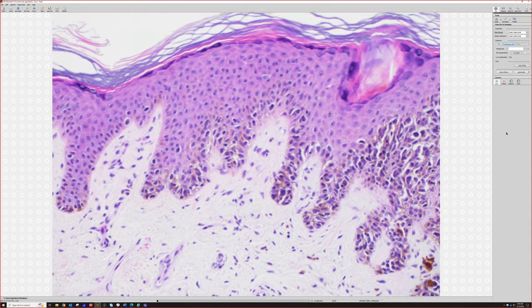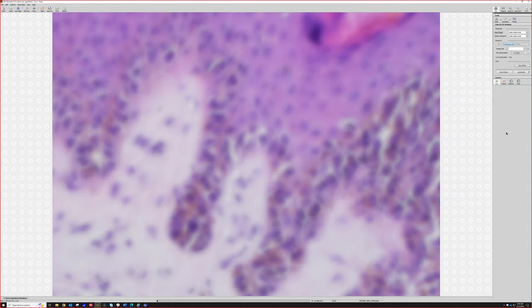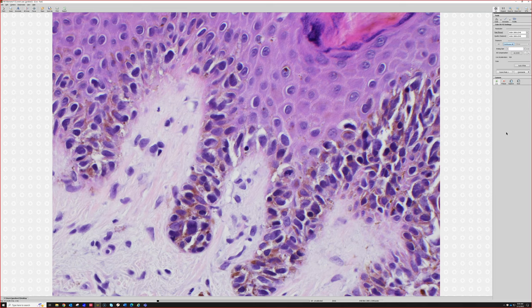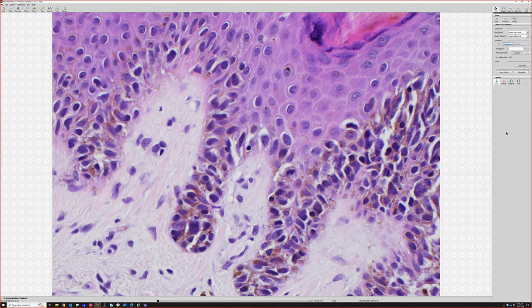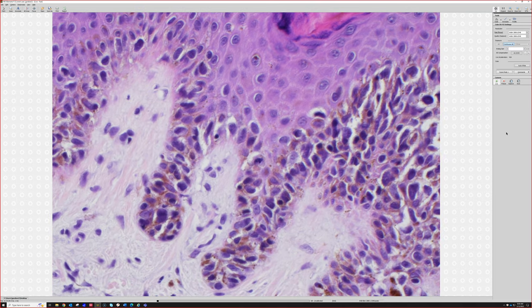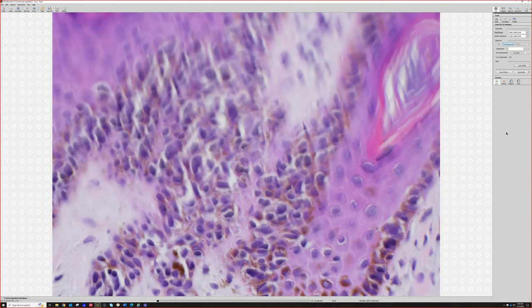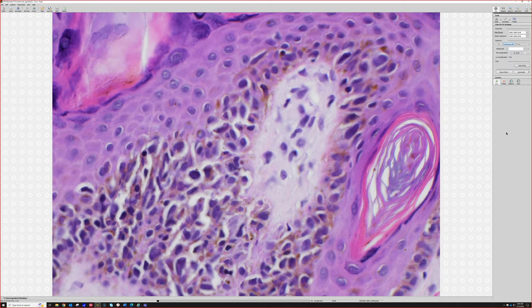And they're enlarged and atypical. We can even see a junctional mitosis in one of them right here. Sometimes it's hard with junctional mitoses to know, are they really in a melanocyte or are they a keratinocyte? But right here, there's so many melanocytes, I think it's probably in a melanocyte, and they're very hyperchromatic, right? So they're atypical and they're confluent.